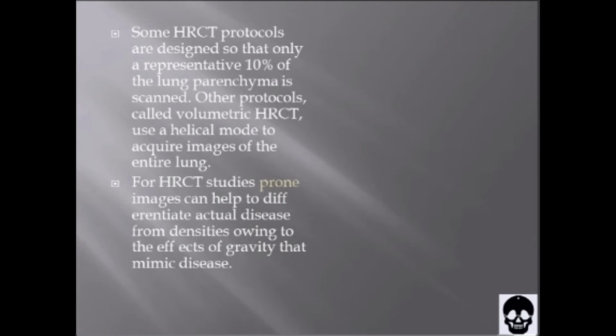Many high-resolution CT protocols, both volumetric and axial, include more than one series of scans. In all patients, there is a gradual increase in attenuation and vessel size from anterior to posterior lung regions owing to the effect of gravity on blood flow and gas volume. In addition, there can be atelectasis in the most dependent lung, the side touching the CT table, that can mimic or hide lung disease.